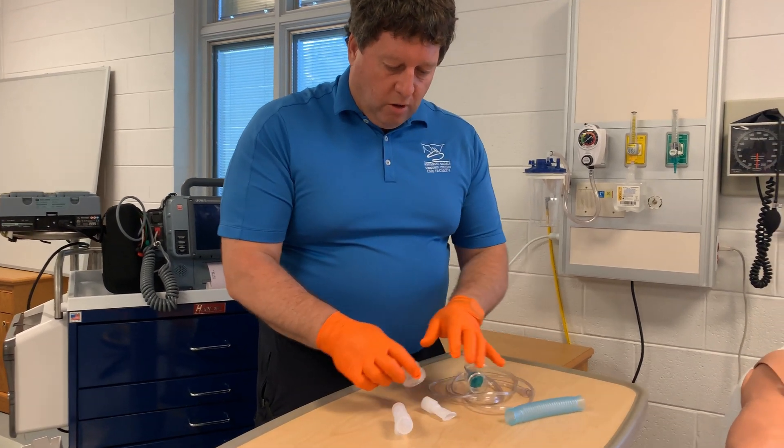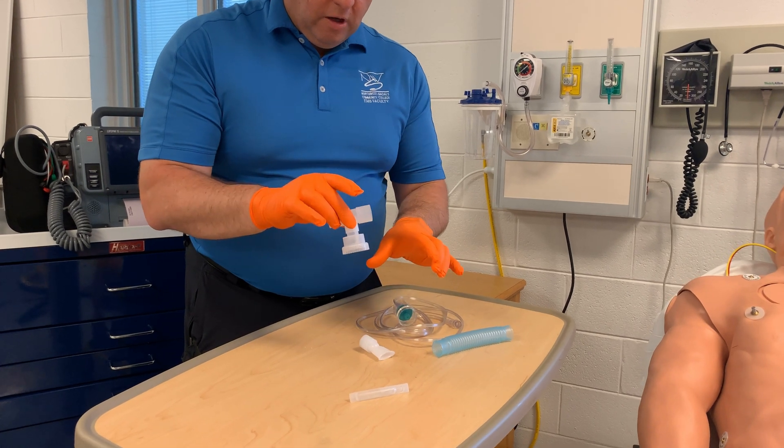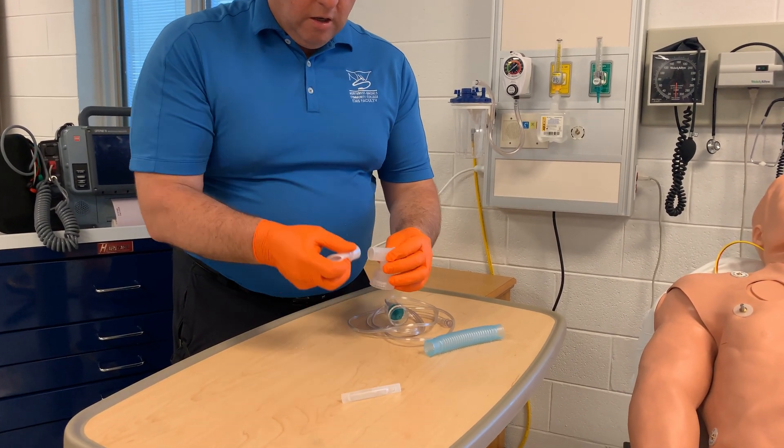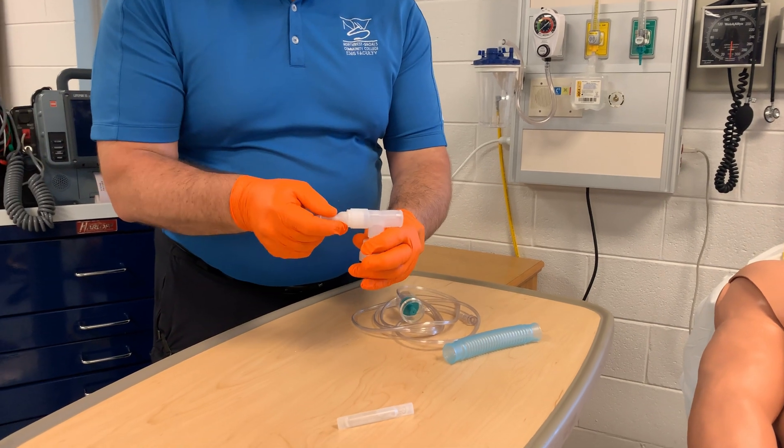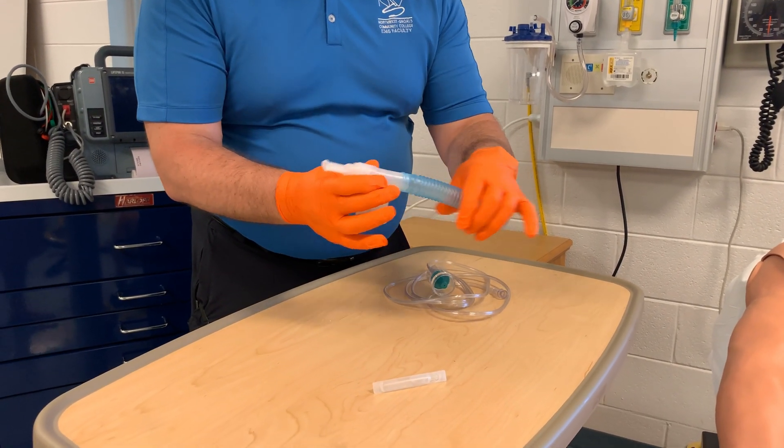I usually start by trying to assemble all the small pieces. The key piece goes on that and then on each side they have pieces. One — the mouthpiece — is what the patient's going to breathe in and out of, and this is just a reservoir of material.